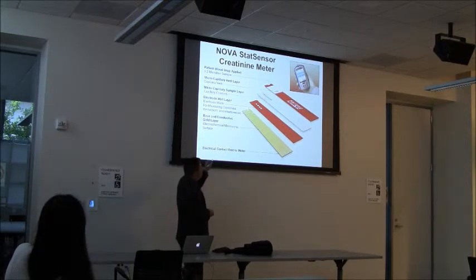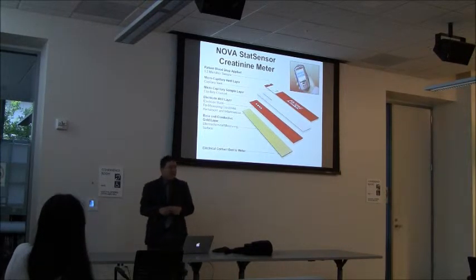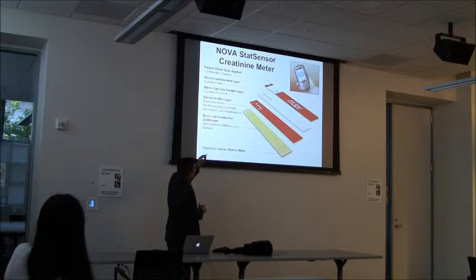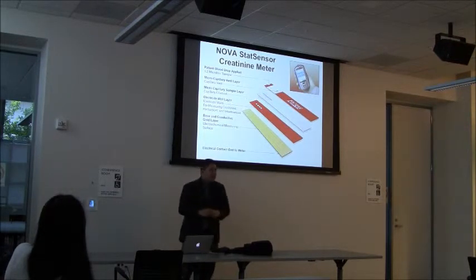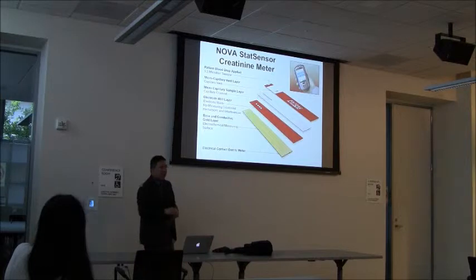Since these are also enzymatic reactions that generate electrons through the redox reaction, if you have something like ascorbic acid, vitamin C, which is very common, it's an antioxidant. It starts gobbling up all the electrons, and you'll have an erroneous result on these devices. So these sensors right here, these different wells, will correct for that. The hematocrit side, the red blood cell side, actually uses impedance. The amount of red blood cells in there changes the impedance, and it will correct for that. It's actually a linear relationship for hematocrit.